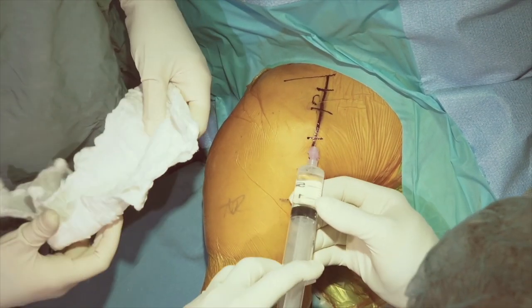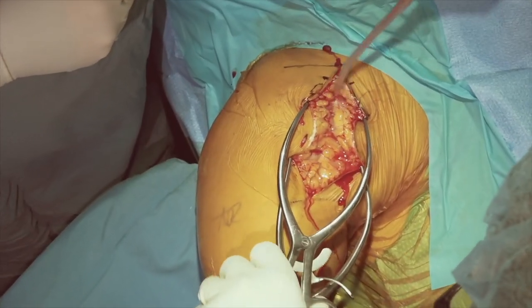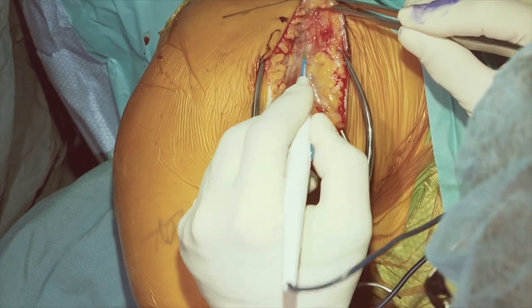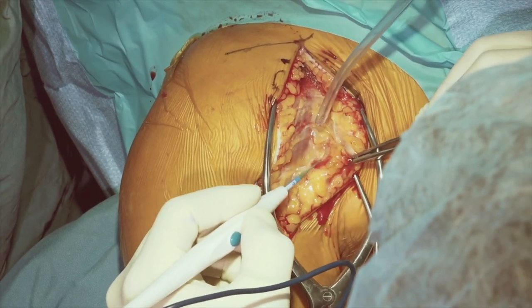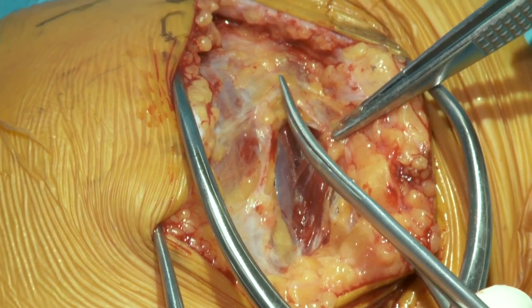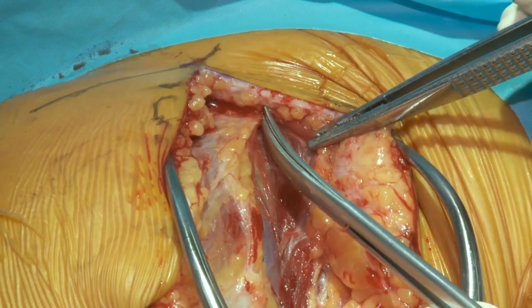In addition to the interscalene block she receives, we will also anesthetize the skin for a deltopectoral incision. We'll proceed through the skin and then take our Gelpi self-retaining retractors. As we go through the skin, we're looking for our first landmark for the deltopectoral interval, which is the plane of the fat, which identifies where our cephalic vein is located. Once we identify the fat stripe, that will tell us where the deltoid and the pectoralis major are. Then we'll unroof the vein and take it laterally with the deltoid, where it gets its primary contribution.